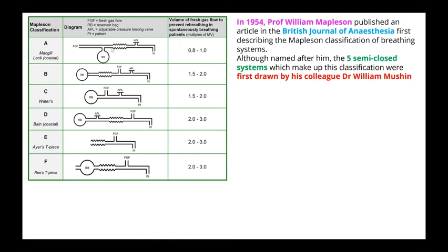Nowadays, with the modern anesthesia workstations, you have hardly any chance to use this particular circuit. Most of you are using the double corrugated or a single unicorrugated coaxial circuits for anesthetic or even pre-oxygenating the patient. So this requirement for the minute ventilation is a very important point in the functional analysis. In order to avoid rebreathing, you must use a fresh gas flow equal to the patient's minute ventilation, 0.8 to 1 times the minute ventilation of the patient.